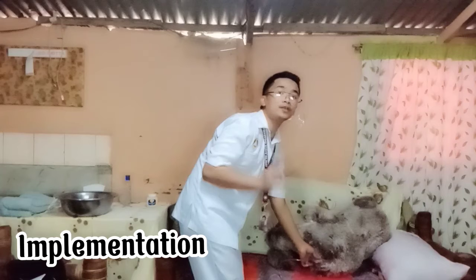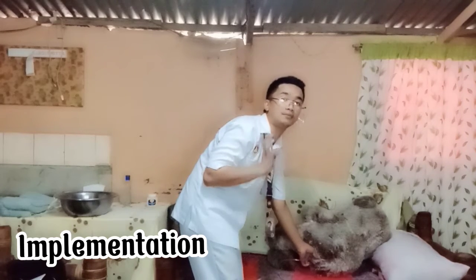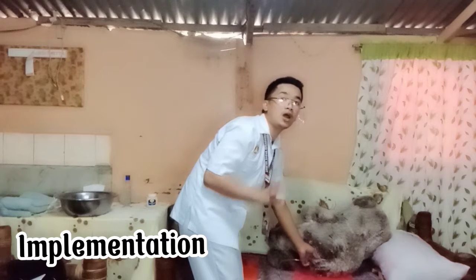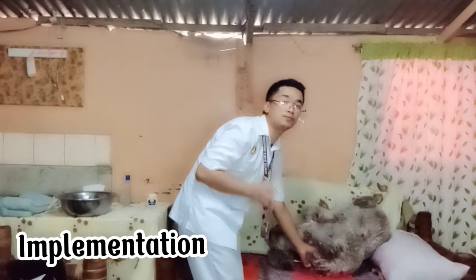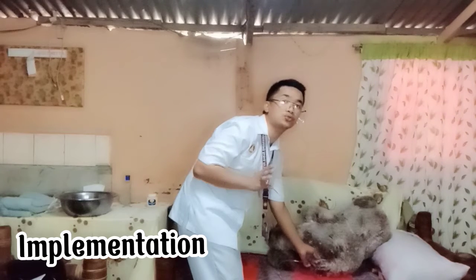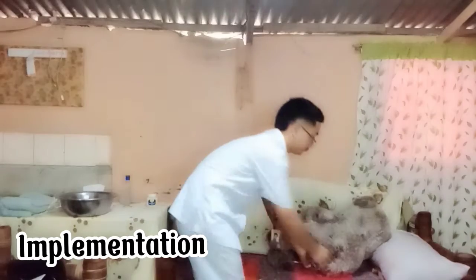Then, always remember to never force tube or solution entry. If instilling a small amount of solution does not permit the tube to be advanced or the solution to flow freely, then withdraw the tube.